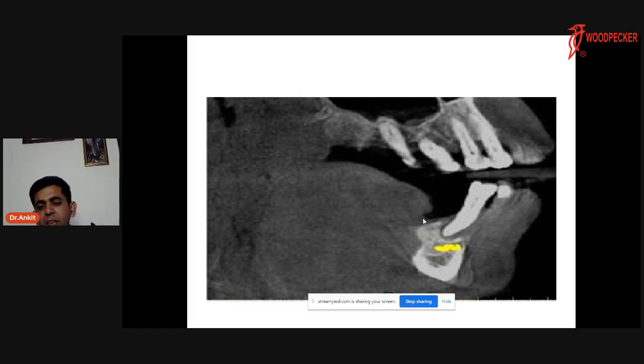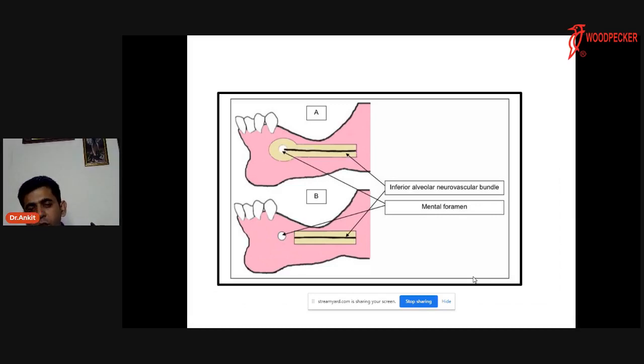So what we did is we distalized the nerve, and at the same point of time, what we understand is its approximation to the implant should be properly monitored and should be maintained at the same position, because of other complications like neurosensory deficit that might range from grade 1 to grade 4, or other motor sensory supply issues, which are though rare when we deal with a sensory nerve like the mental nerve, might happen when we do the distalization of the nerve. So let us discuss that literature again. This is what the diagram of the distalization would look like.